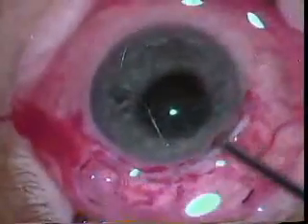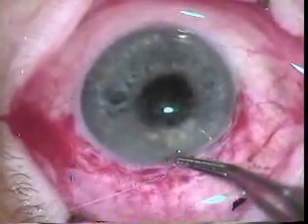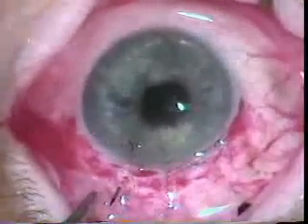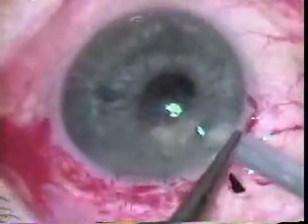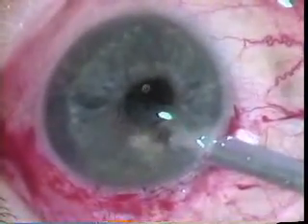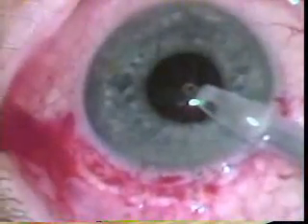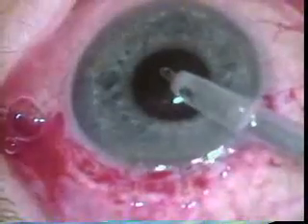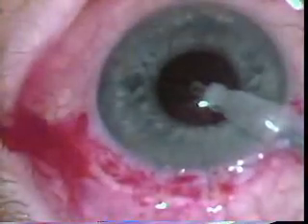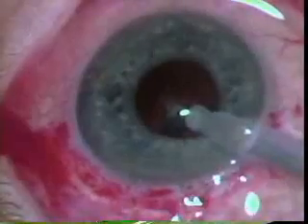Now the residual cortical material is removed after closing this one safety suture. A couple of additional 7-0 Vicryl sutures are placed to allow closure of the eye during the irrigation-aspiration. Irrigation-aspiration is used to remove residual cortical material. You can see how the pupil came down following expression of the nucleus, which was not uncommon when performing an extra cap. The pupil got a little bigger during this, probably because of the epinephrine in the fluid.